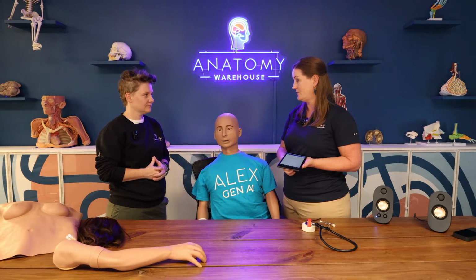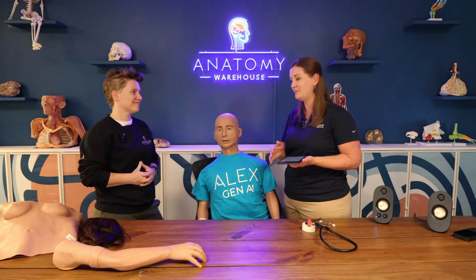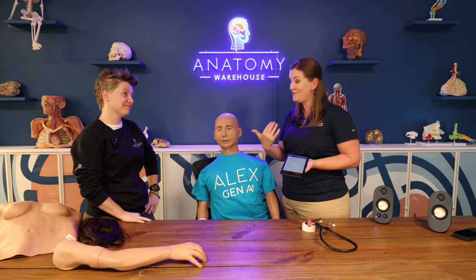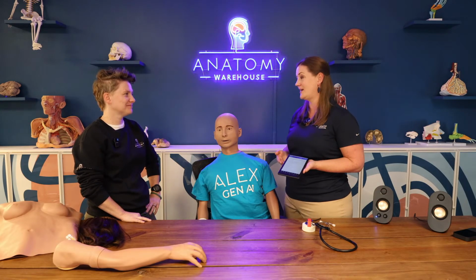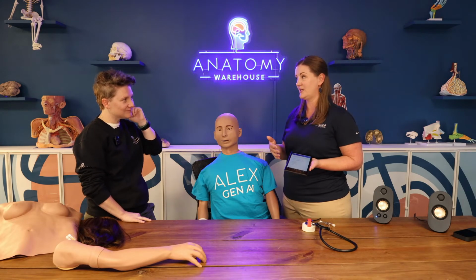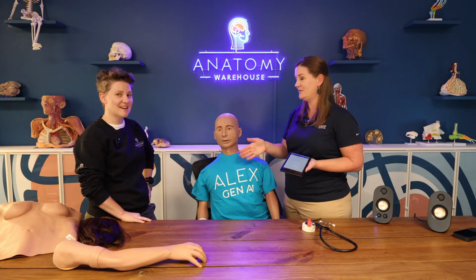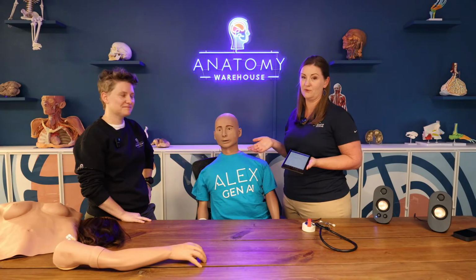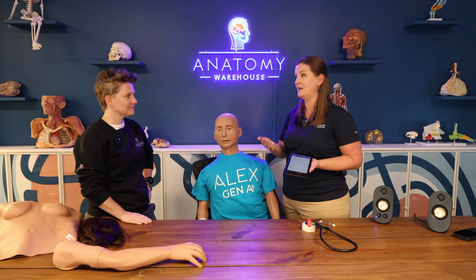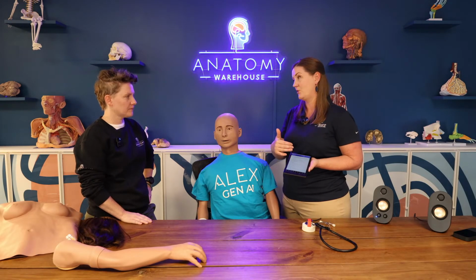And I think those soft skills are absolutely needed, coming from eras of being behind a computer all the time or behind a camera, where conversations can get pretty one-sided. So having that iris camera and the ability to really show if the student has turned away from their laptop, have they looked at the patient, all of these things are absolutely being captured with the Alex patient mannequin. If the simulation is demanding a carotid pulse check versus a radial pulse check, the software program is picking all of that up.